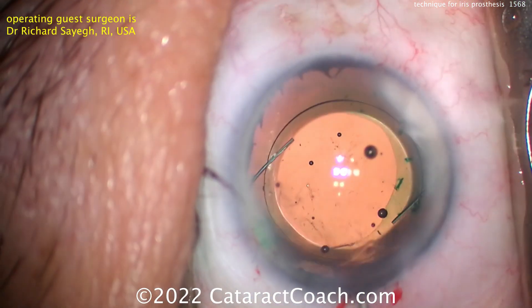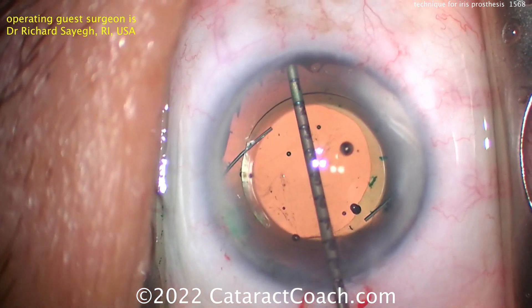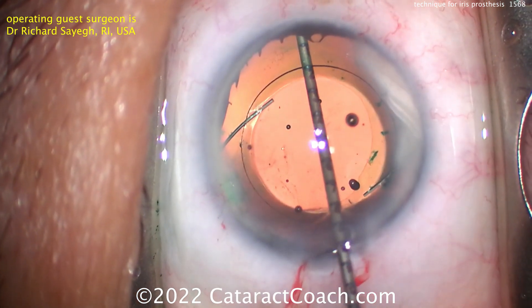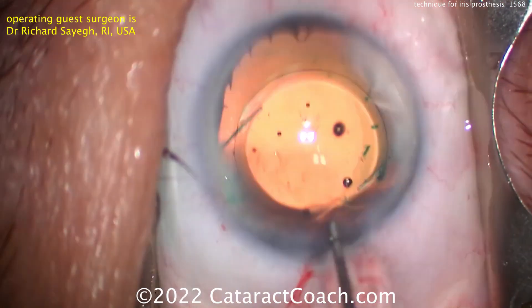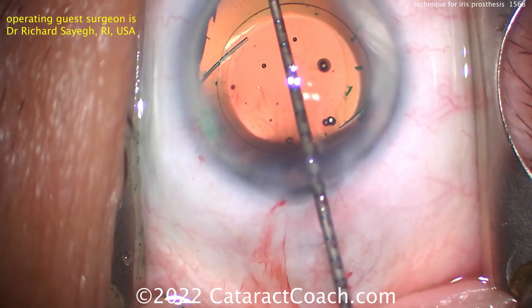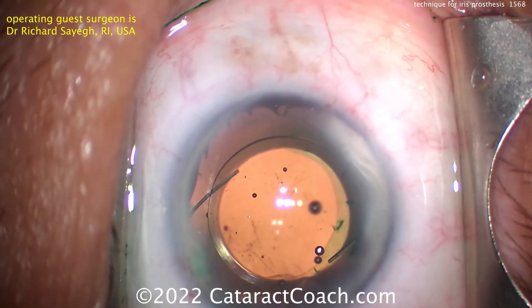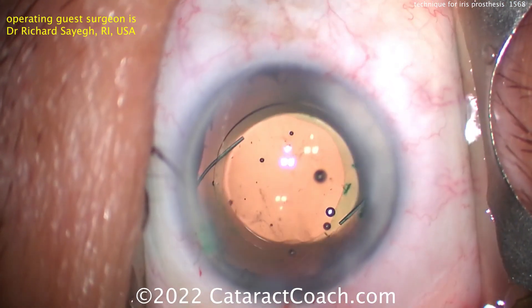The capsular bag needs to hold the IOL, the CTR, and on top of that, the implant. Using an intraocular measuring device to figure out how big to make the prosthetic iris — sometimes you can get these in a larger size and trephine them down to the desired diameter. Careful measurement is important. Notice he's measuring inside the eye, so the corneal magnification effect doesn't really have much impact.